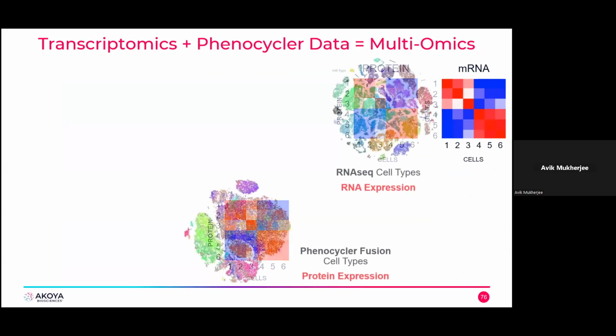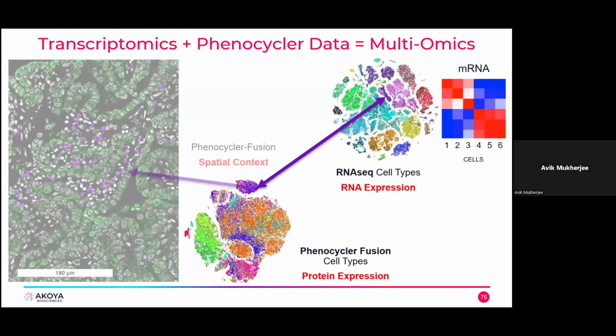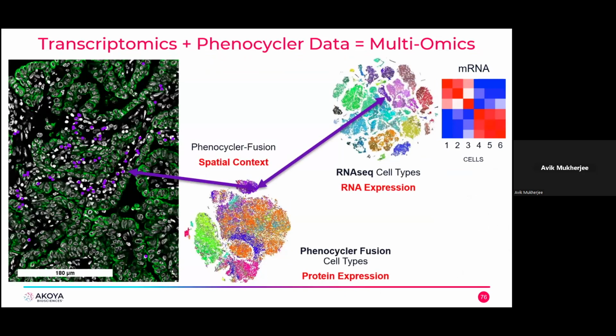So the basic goal is, this is just a conceptual diagram, that you want to know your RNA, you want to know your protein, go into that single cell and come back and understand the whole picture of your tissues.